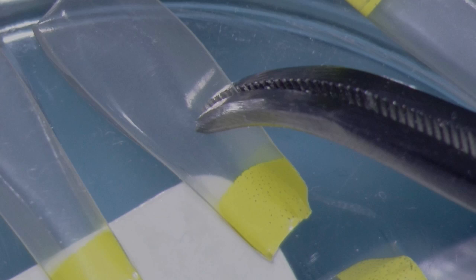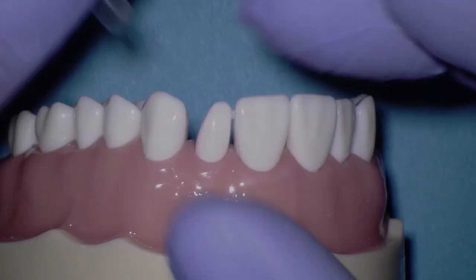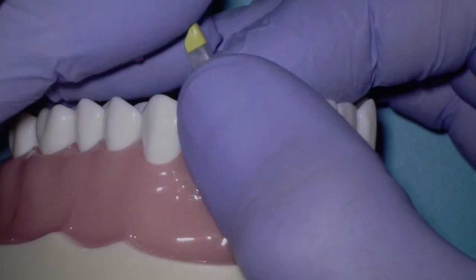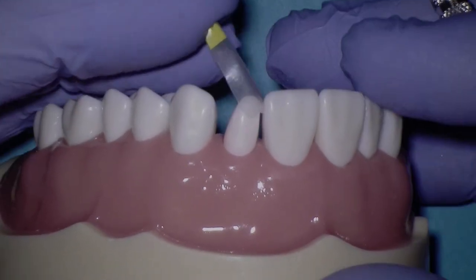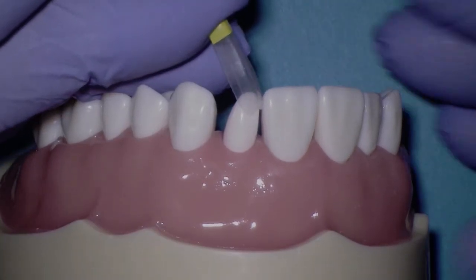Let's go ahead and get our matrix, and we can reuse this matrix and rinse off the Vaseline, or we can get a fresh matrix if you're worried about contamination. So now I'm bringing in the yellow BT matrix. Make sure that the color goes away from the tooth toward the incisal edge. You're going to want to bring the matrix in at about 45 degrees into the embrasure, just like so. That's because the embrasure has a certain angle and the matrix has a lot of curvature.